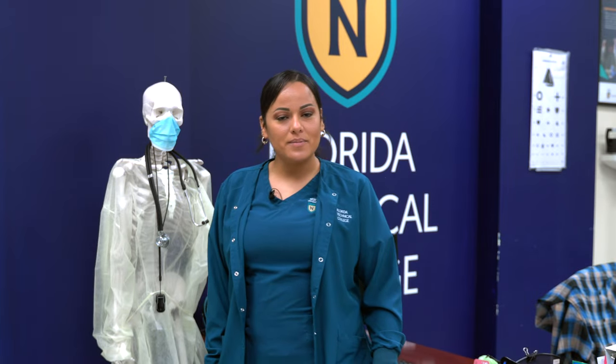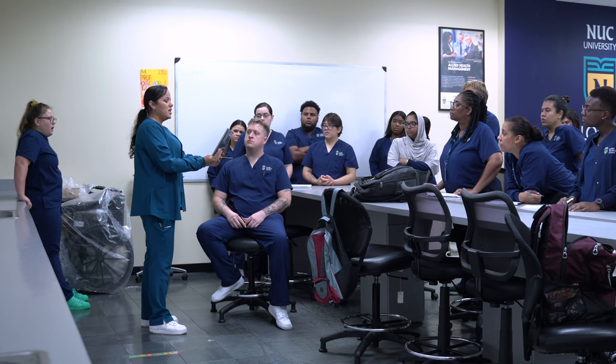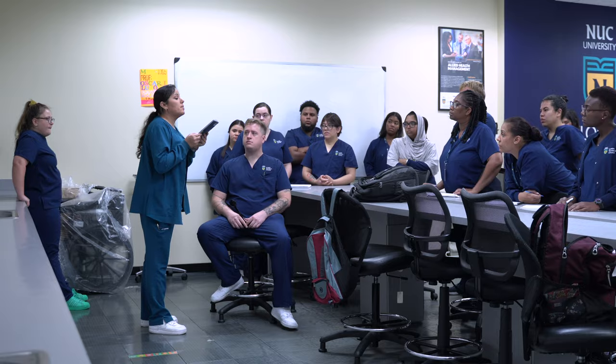Hi, my name is Ms. Otero. Today we are in clinical procedures. We are going to be practicing how to check for visual acuity doing Snellen, Ishihara, and Jaeger.